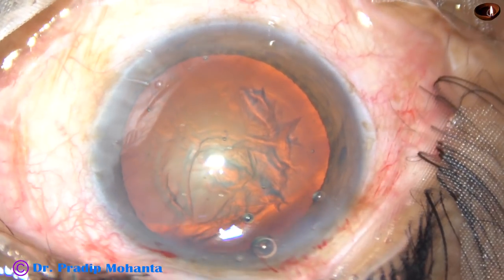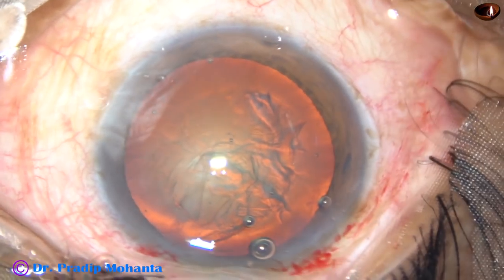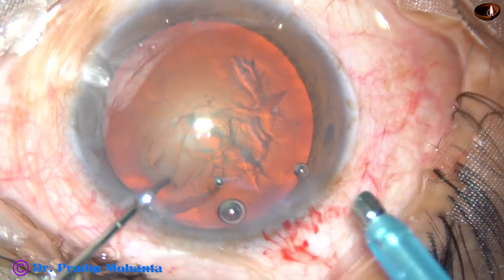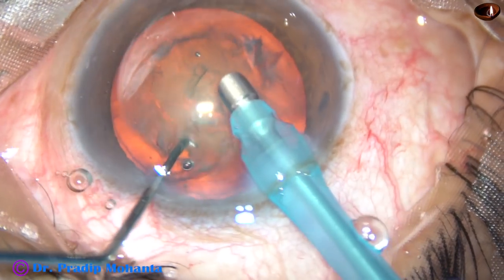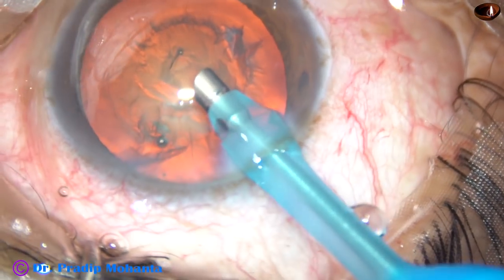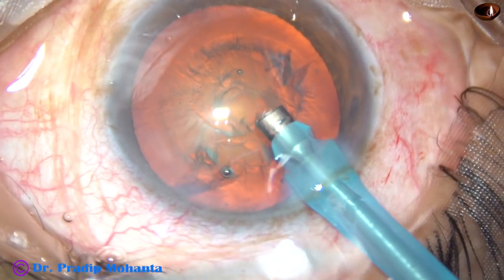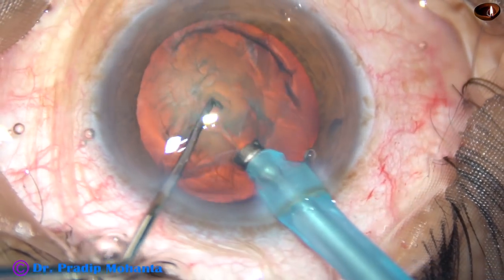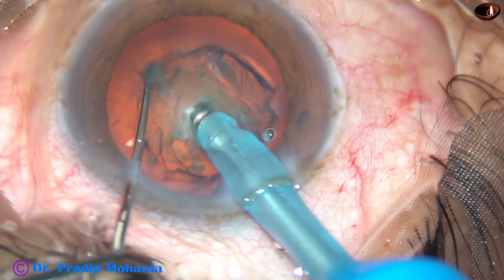Viscoelastic substance is again injected, and now is the time to introduce the tip of the phaco handpiece. This is a totally unedited surgery and you are going to watch each and every single step. The tip goes beveled down, some superficial cortical matter is removed, and then the handpiece is turned so the bevel is towards the corneal endothelium.